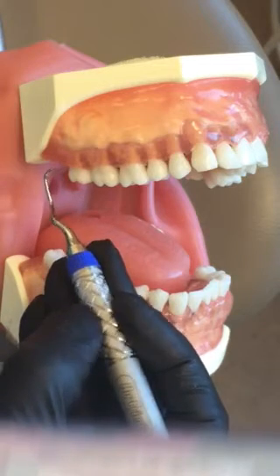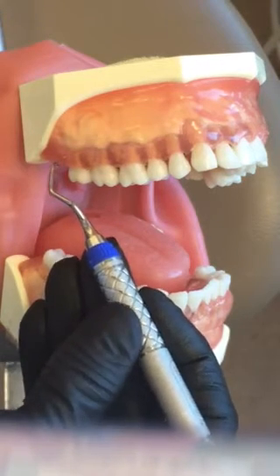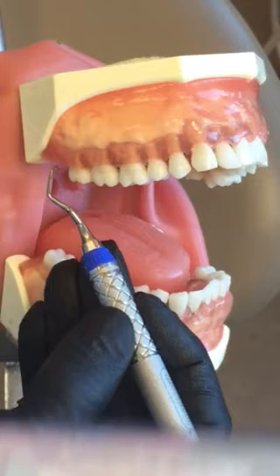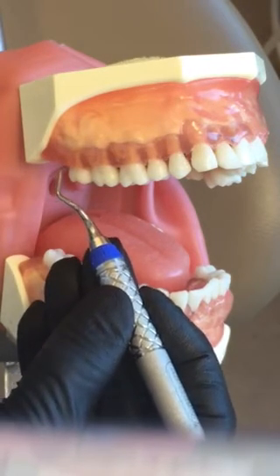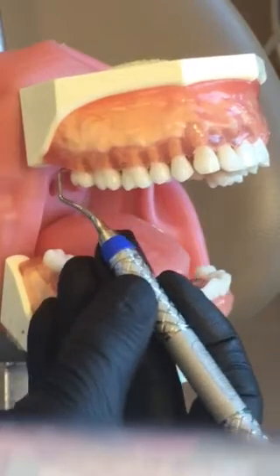The Gracies are automatically offset. Your Anna Patterson Gracies are offset at 60 degrees working angulation, so you don't have to worry about leaning your curette towards the tooth.